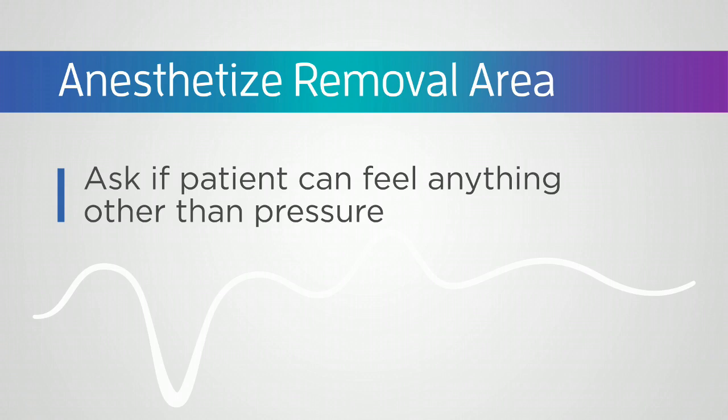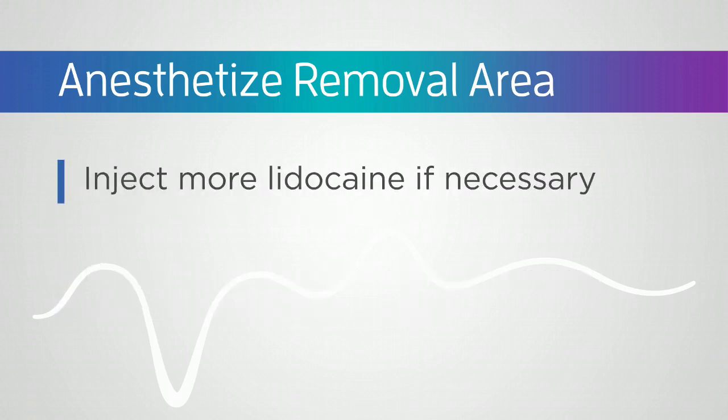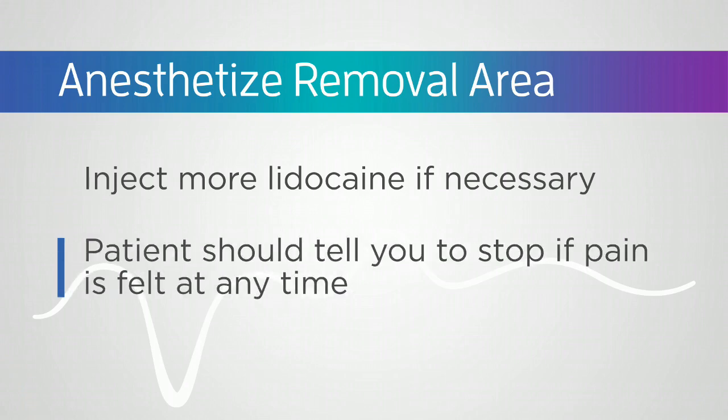Ask the patient if he or she can feel anything other than pressure. If yes, wait another minute or two prior to checking again. Inject more lidocaine at this point if necessary, while maintaining sterile technique. Explain to your patient to tell you to stop if pain is felt at any time.